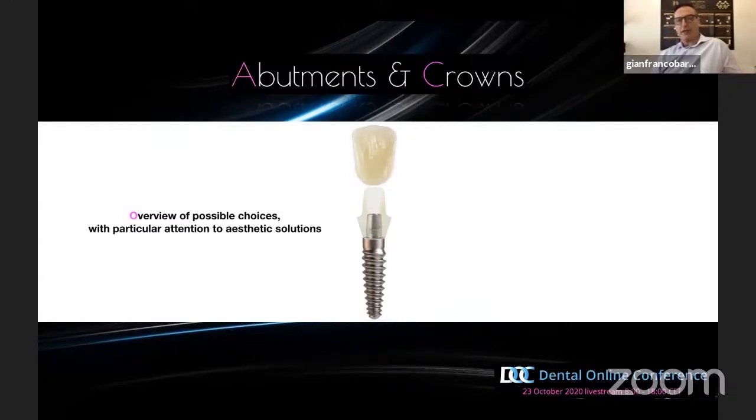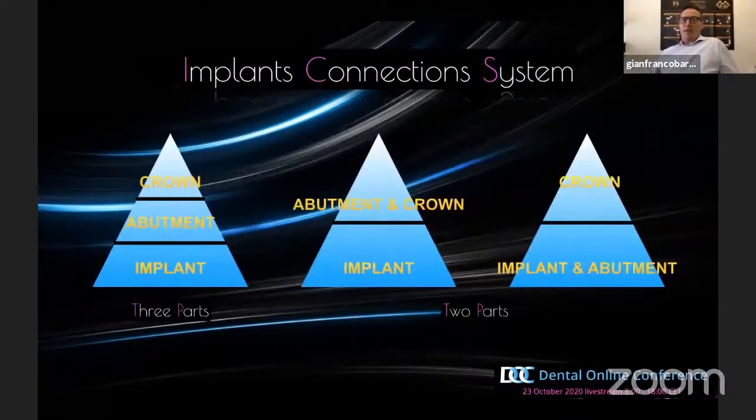We don't care this morning about full arch restoration or Toronto restoration of any kind, because it's a different way to think about that. This morning we are going to talk about single tooth restoration on implant.